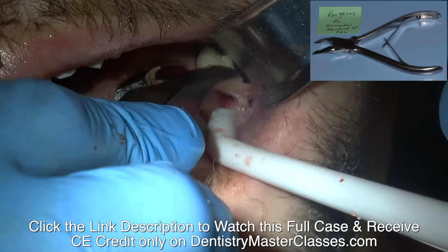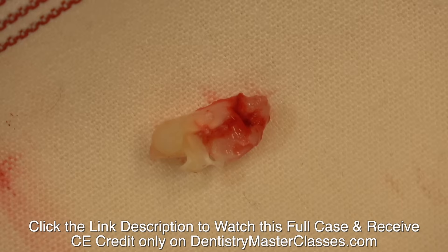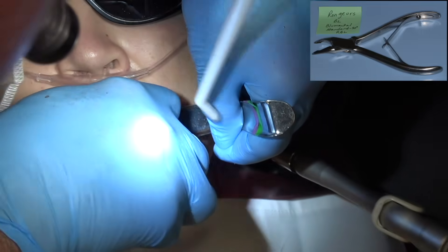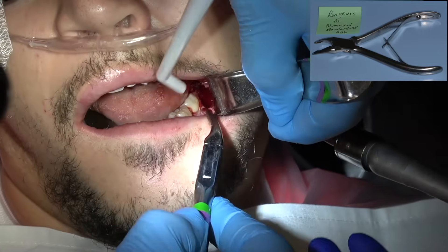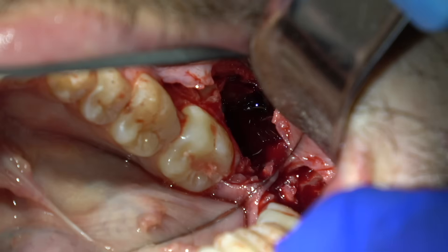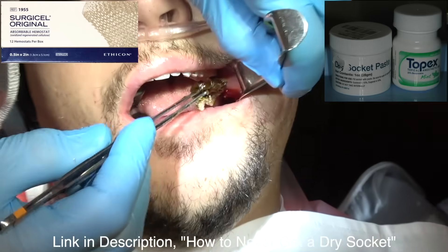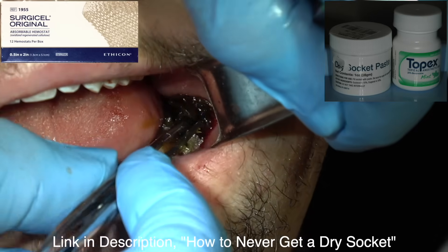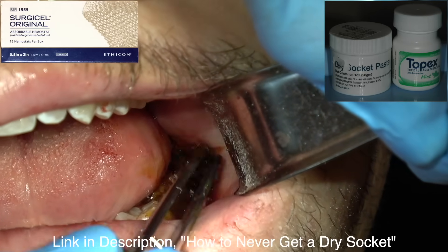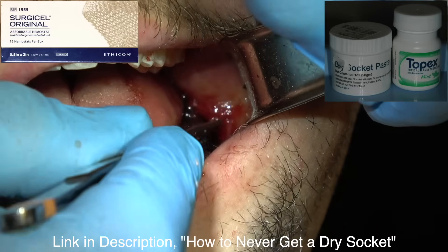And here it comes. I'm going to remove the follicular sac. Here's how it fits together — both roots. And then we're going to pack it.